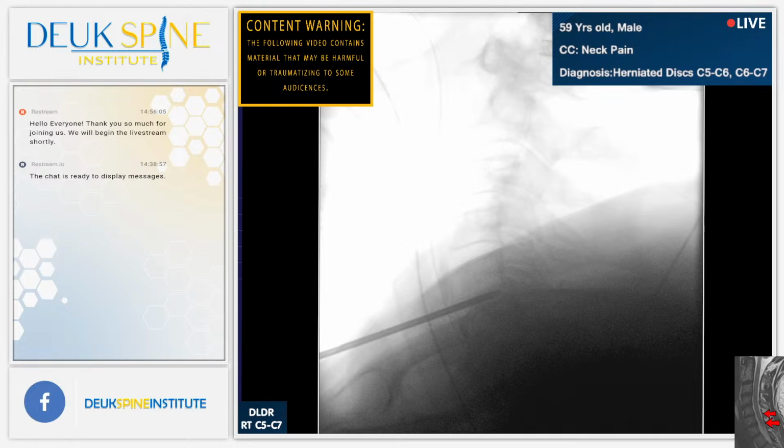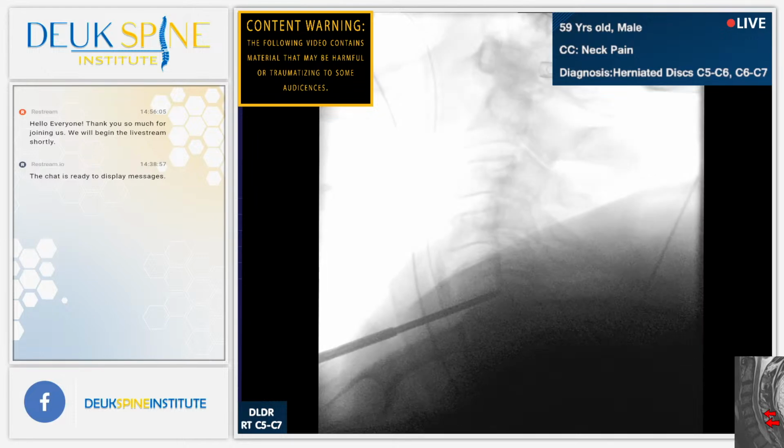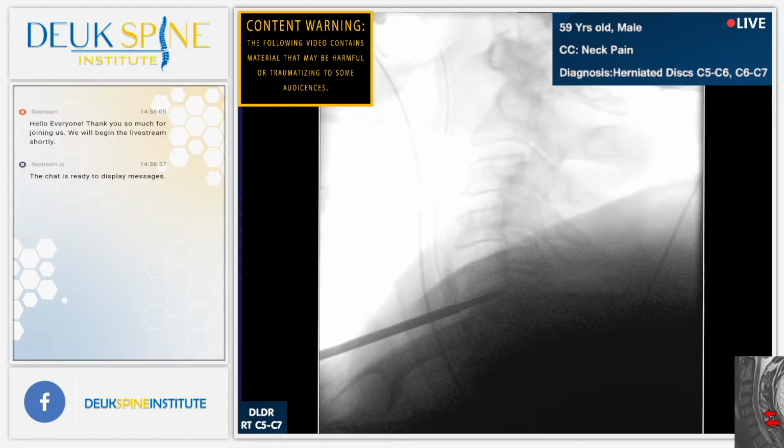Now, one of the other things we've got to think about is his collarbone, shot? Because his collarbone can block the access to the disc at C5-C7. I've just got to see whether or not we can get down there. Right now I'm being optimistic. I think we can, but we won't know until we get a little further along. Shot? Beautiful. All right. We are making progress. New tube?